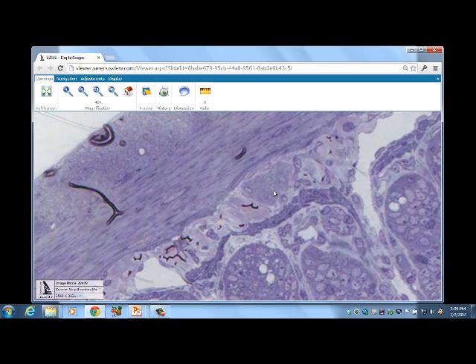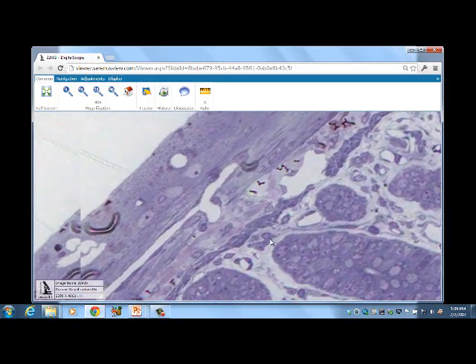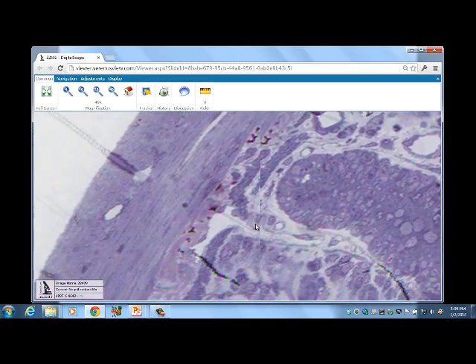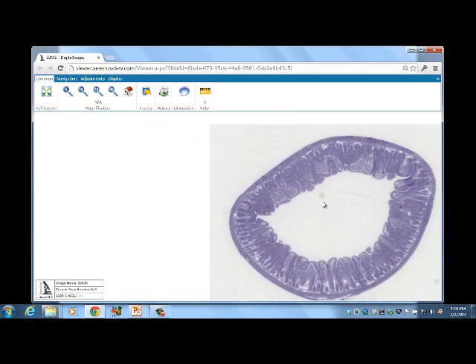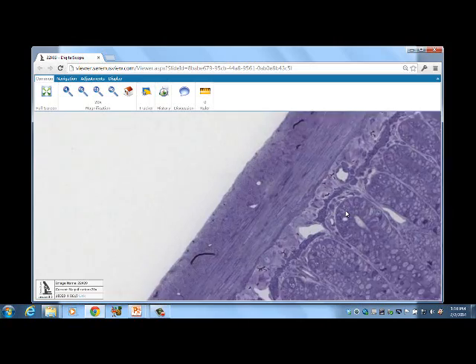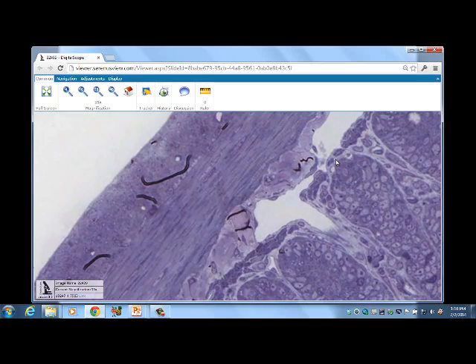There's another plexus of nerve that we see in through there. And here, in addition to Meissner's plexus, there's an Auerbach's plexus. So this is the nucleus of a nerve cell that's located in the smooth muscle layers out through there. So we see the whole nucleus and the nucleolus of that cell. More mast cells that we see here. And let me just take a look at this one and see if we can see the Auerbach's plexus a little better.